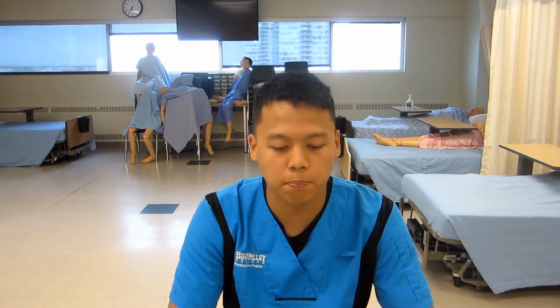The 2 nurses on the stretcher side of the bed should gently pull the sliding board toward themselves. Roll the patient to her side and remove the sliding board. Center patient on the stretcher with patient body in alignment. Make sure patient is comfortable and raise the rails on the stretcher. Keep patient safe and protect yourself from injury.